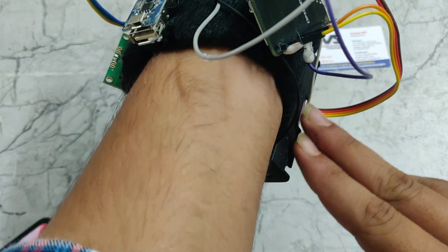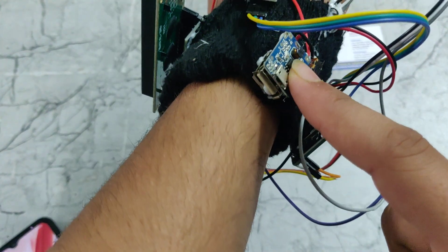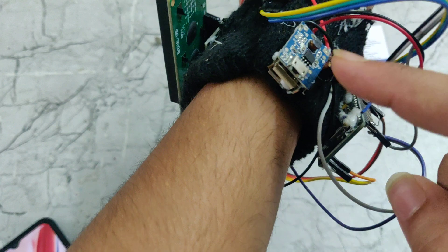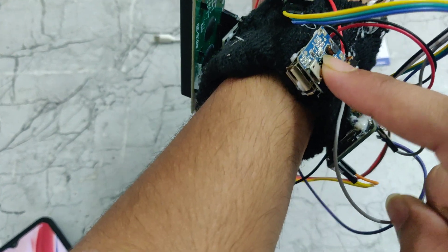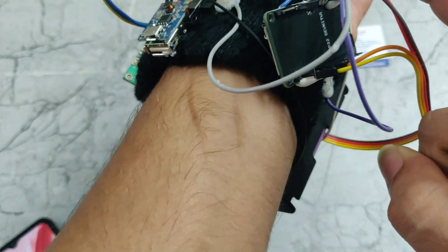Coming to the power supply, we are giving 3.7V to this USB module. This USB module will boost up the voltage — it takes 3.7V and boosts it up to 5V. That 5V will be given to this ESP32.